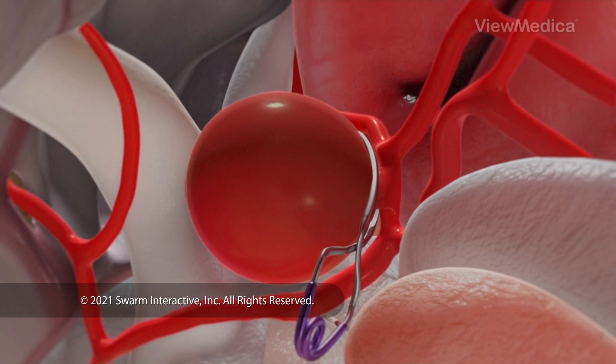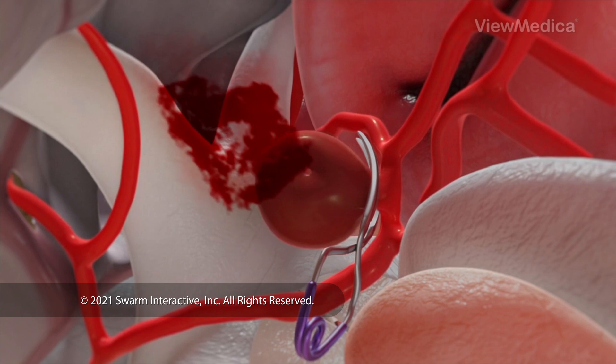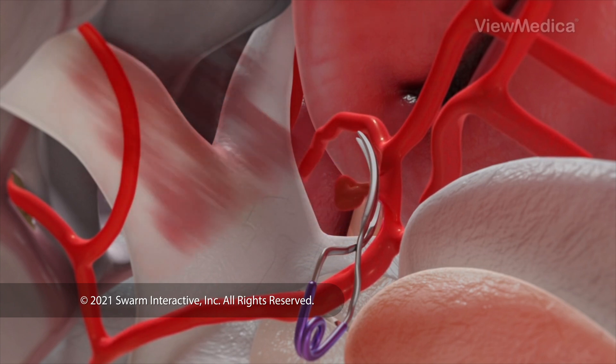Then the bulge is punctured to drain it of any blood. Over time, it will shrink. The clip remains in place permanently.